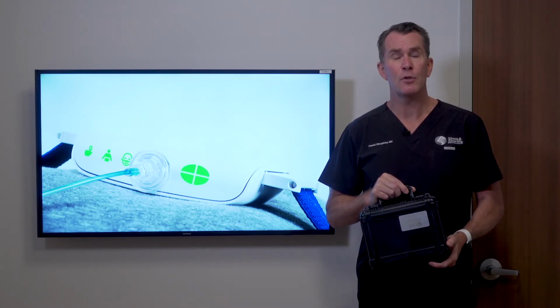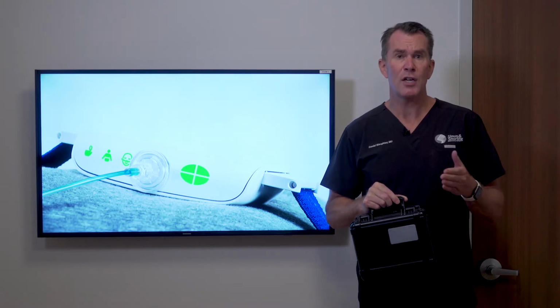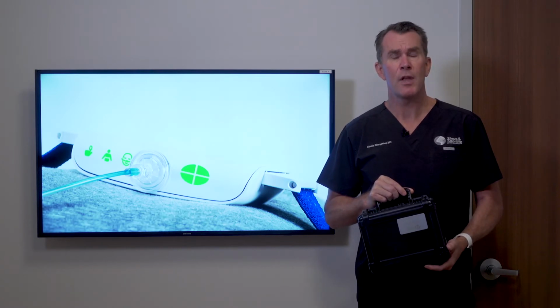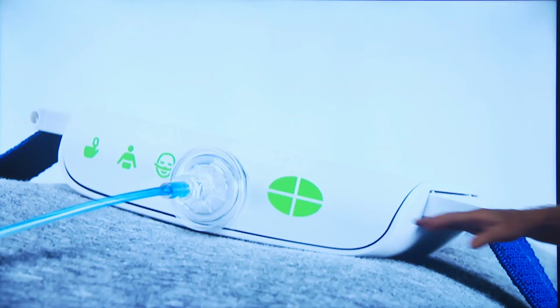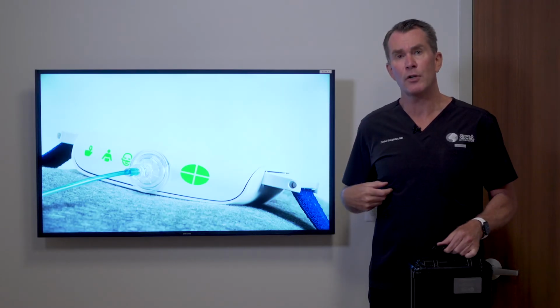Patients can also sometimes do very conveniently even more than a one-night study, meaning changing certain variables to see if it alters the outcome of the study. Home sleep testing devices are quite simple. It's a small device with simple lights that connects to a belt that goes around your chest.